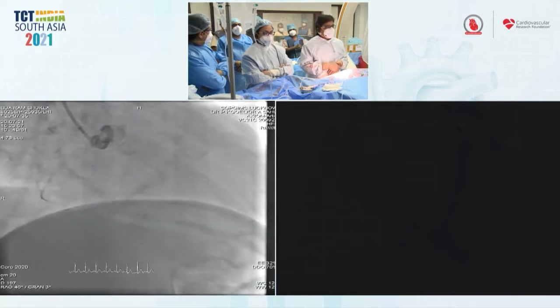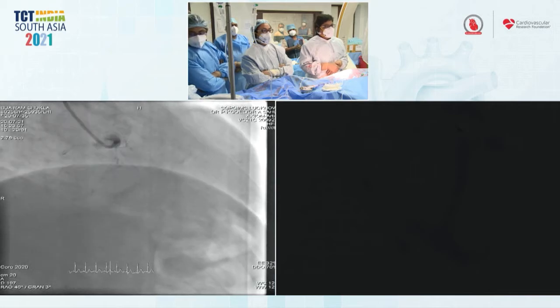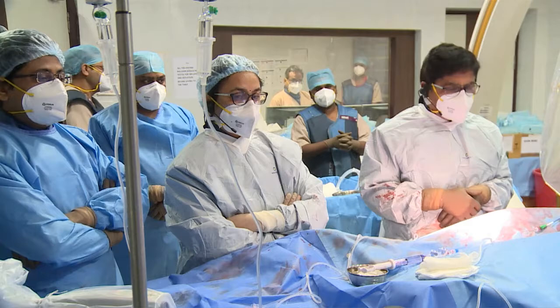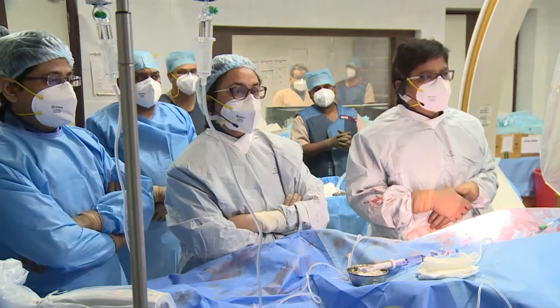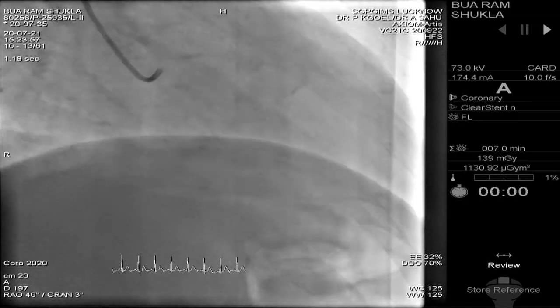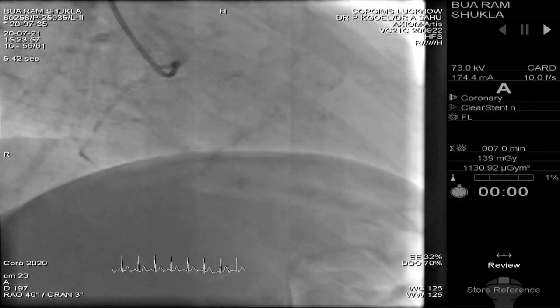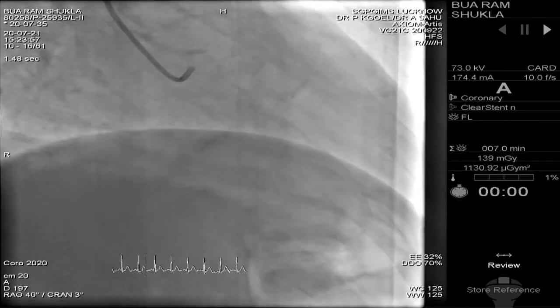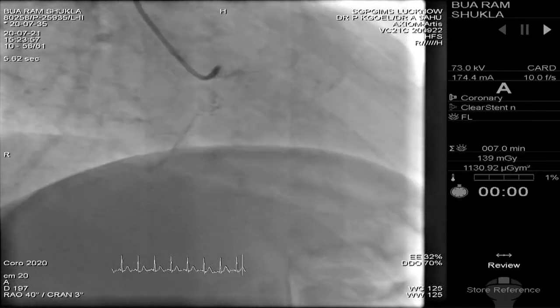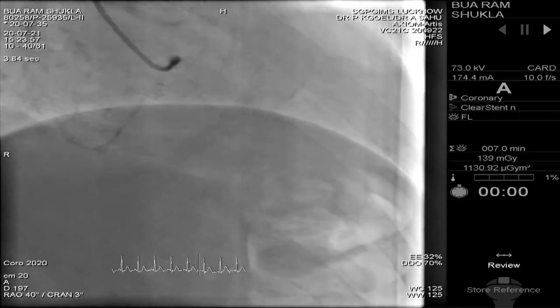One approach may have been to actually intervene on the LAD at the time of the original angiogram. What that would do is try to increase some safer collaterals and open up some septal channels, albeit with the caveat that you may have jailed some of those septals. But I do agree that using an epicardial collateral for that right, which is highly tortuous, other than for visualization, would really be my last resort. Kevin, anything to add on top of that?